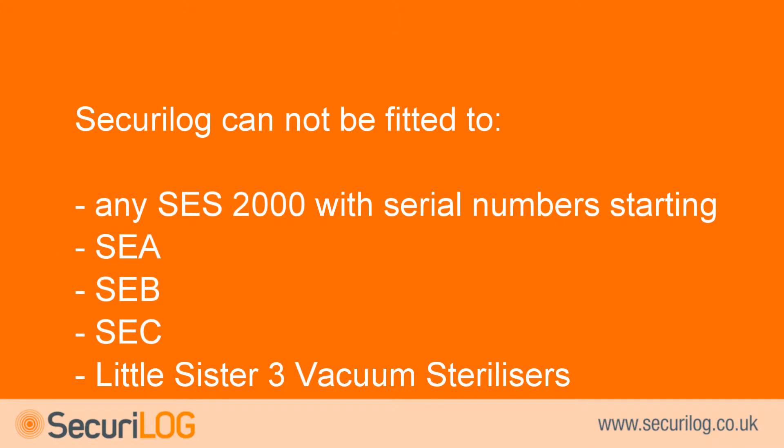Securilog cannot be fitted to any SES-2000 steriliser with serial numbers starting SEA, SEB, or SEC, nor to Little Sister 3 vacuum sterilisers.